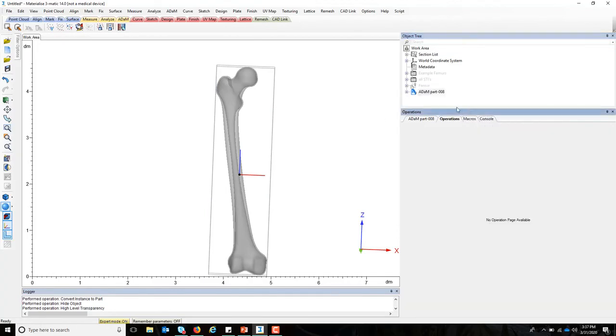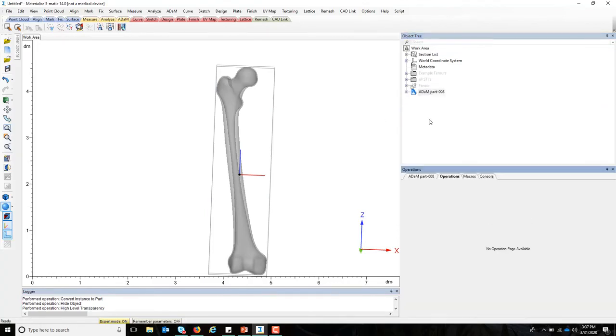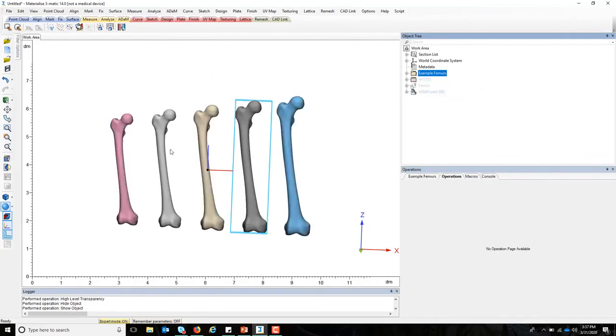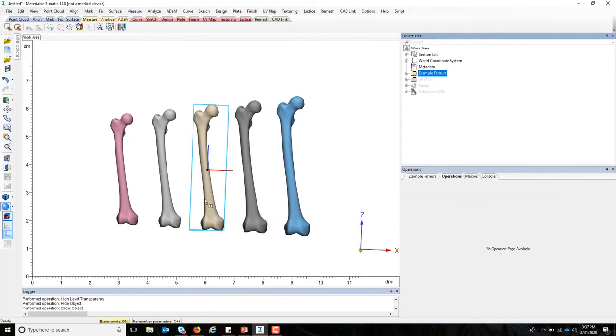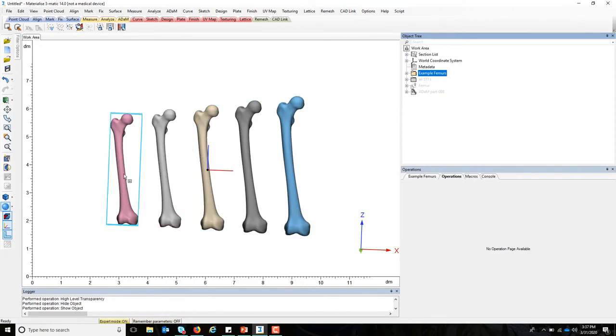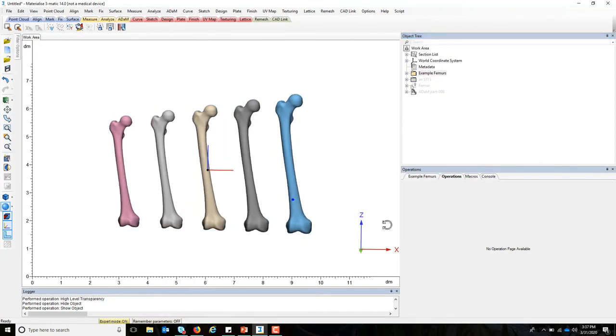Now as a final step, what I'd like to show are just a few different instances that I've created of mode 1 across the board. In the center here, we have the average. We have a plus 1, plus 2 standard deviation. And on the left, we have a minus 1 and a minus 2 standard deviation. And it's really interesting because right away, I can see how much the bone is changing, and I can use this to leverage my R&D.